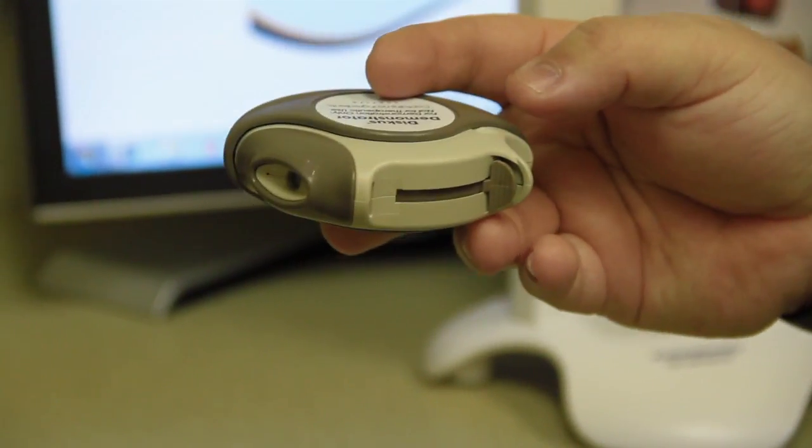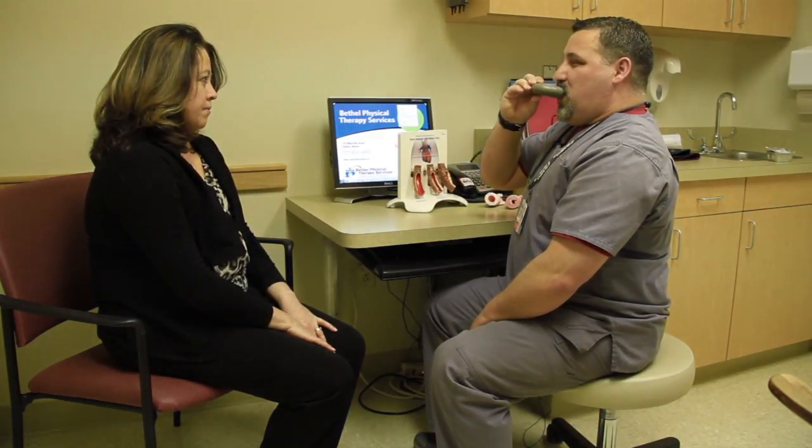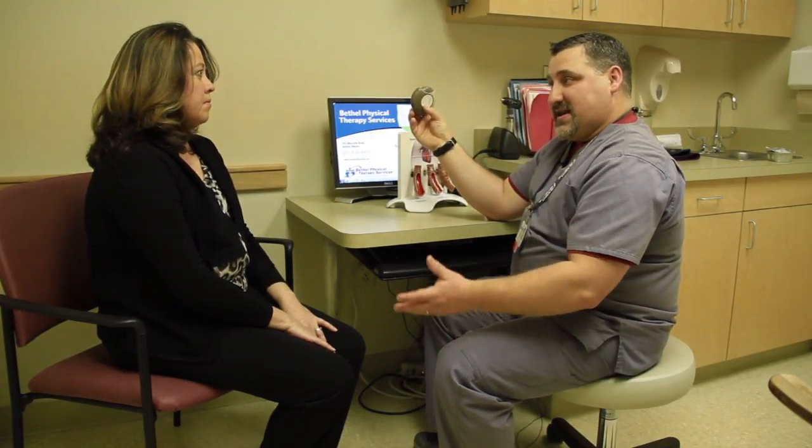I'm going to wrap my lips around the mouthpiece, hold my breath for 10 seconds, and then exhale.